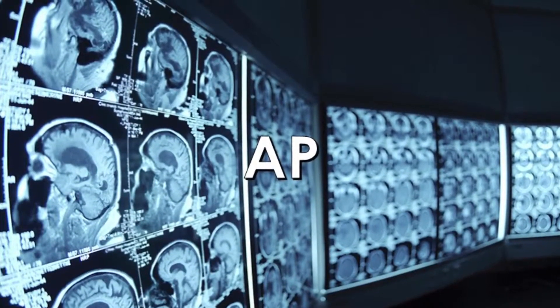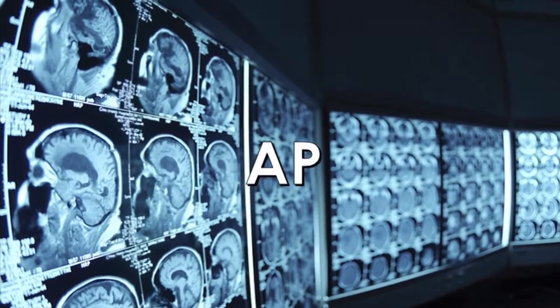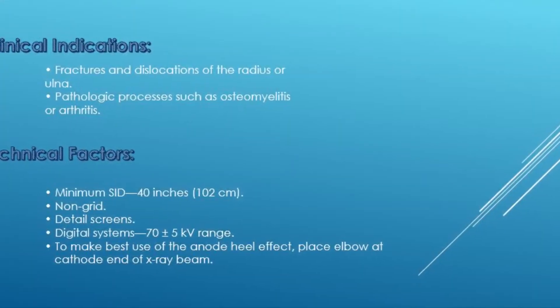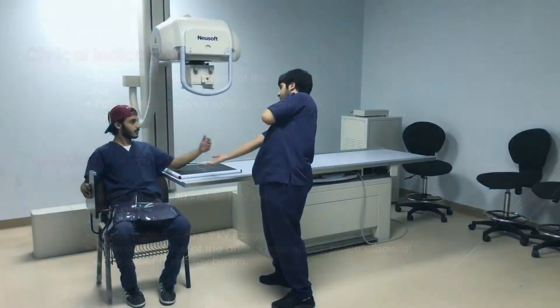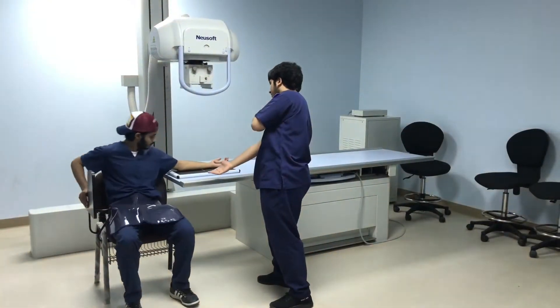Now let's start with the AP position. As you can see here, those are the clinical indications and technical factors that are used in forearm projection examination.